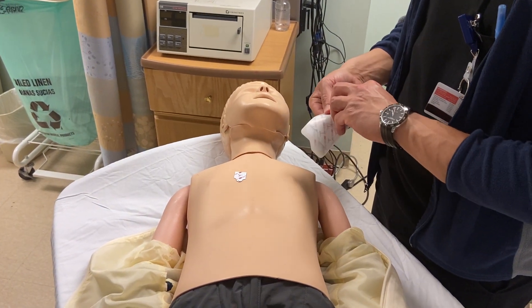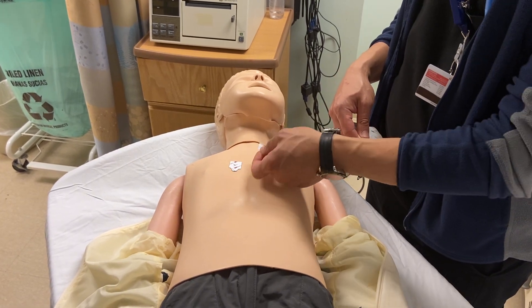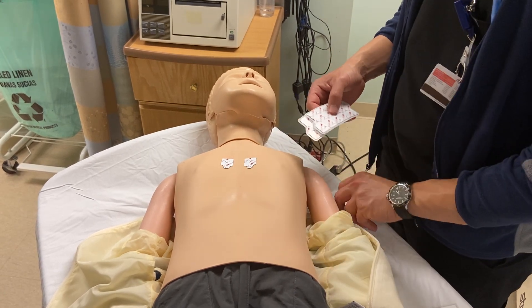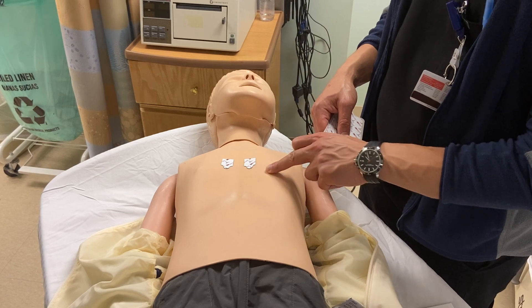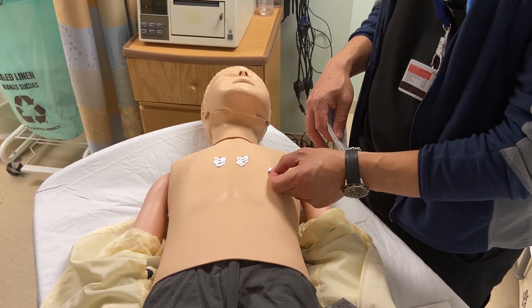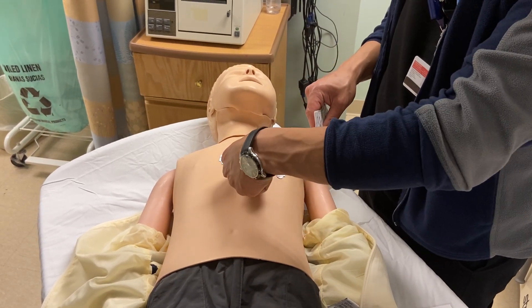We'll find the fourth intercostal space just to the left of the sternal border and place V2, which should be right across from V1. We'll skip ahead to V4, which should be in the fifth intercostal space in the mid-clavicular line. Then V3 will be right in between the two.